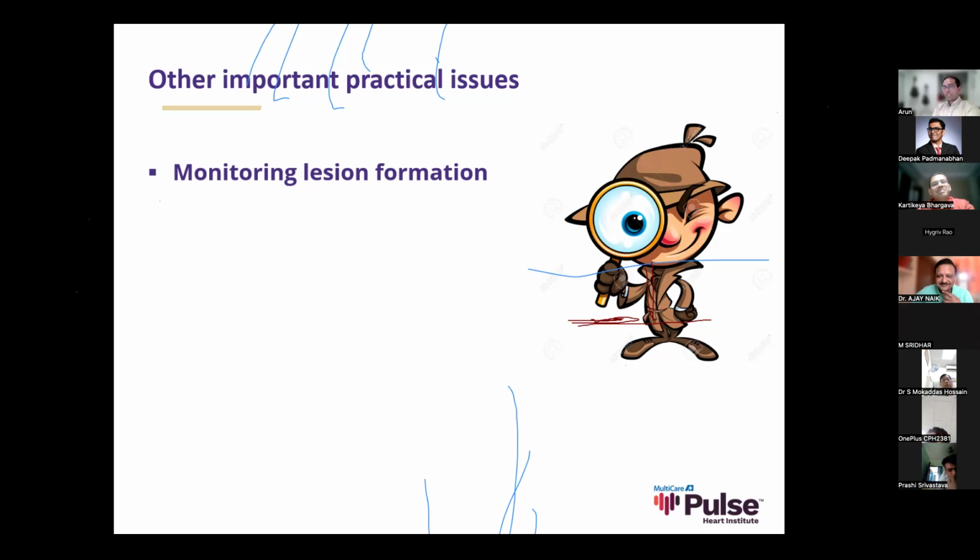For the first question, I wanted to make sure I'm understanding it right. I think it is pretty programmable, right? How much flow you are delivering through the ablation catheter, you can program that. There is a company standard recommendation for each catheter for less than 30 watts and greater than 30 watts.